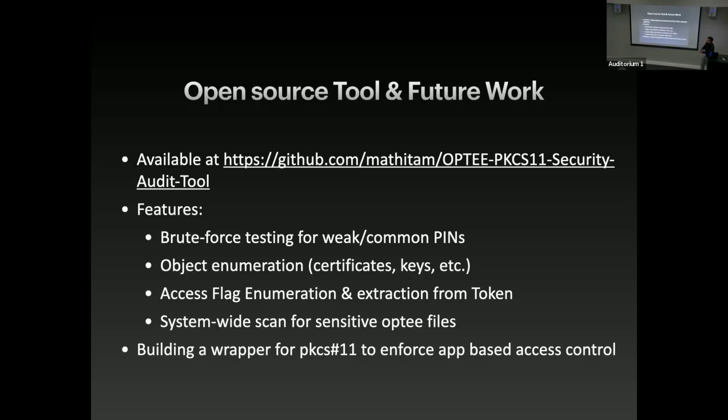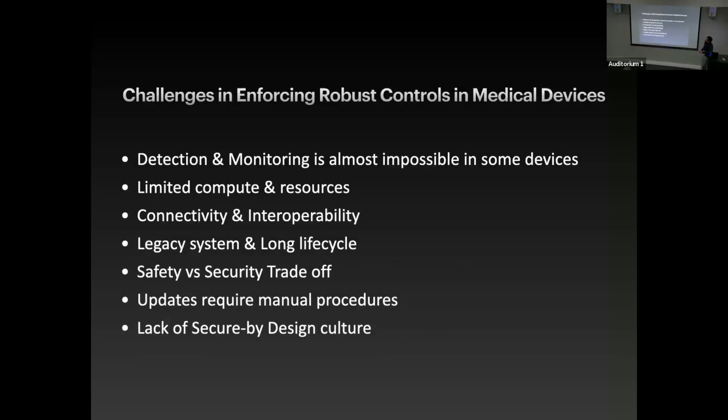I'm also trying to build a wrapper around this PKCS11 to enforce app-based authentication, because as I said earlier, it doesn't go any more granular than user-based. So that authentication is at the user level. So I'm trying to build a wrapper to enforce app-based.